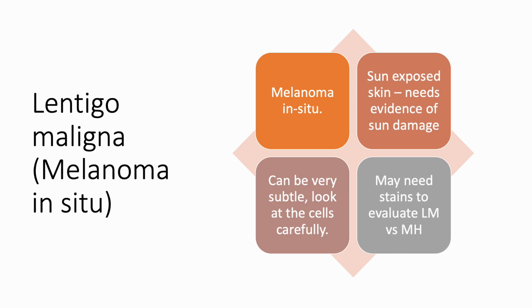Lentigo maligna can be very subtle, clinically and histologically. So when dermatopathologists misdiagnose something, it is usually a melanoma, and lentigo maligna is one of them. You usually need stains to distinguish lentigo maligna from melanocytic hyperplasia. Let's give you a picture.